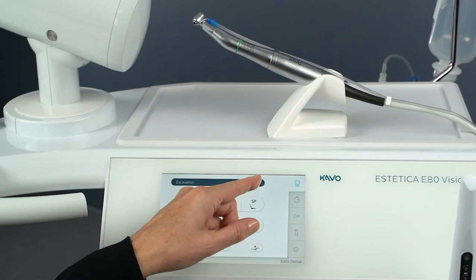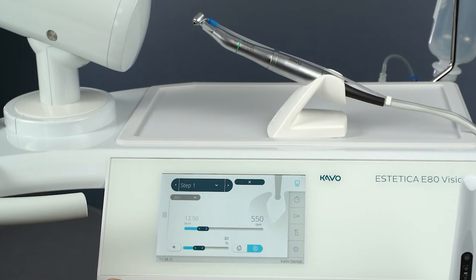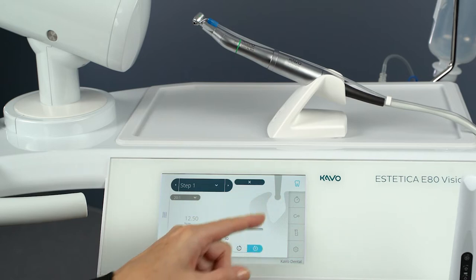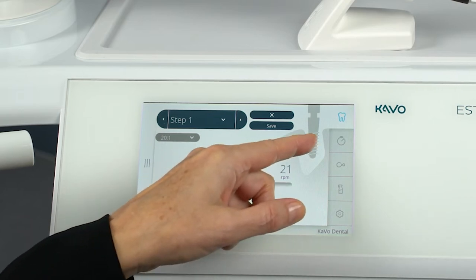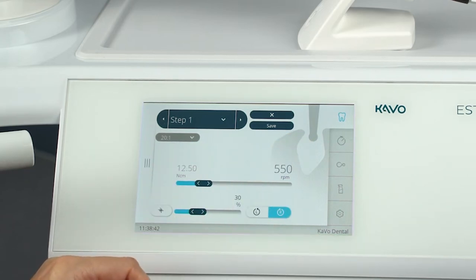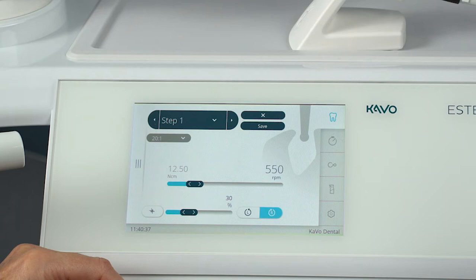Then select the surgery treatment type on the dentist element. Program step 1 now appears on the display. The current program step and the assigned activity are always displayed as an icon. Any activity can be assigned to each program step by selecting the corresponding icon. By visualizing the activity, it is easy to check whether the activity set on the unit corresponds to the treatment step currently to be carried out. In this way, operating errors can be largely ruled out.